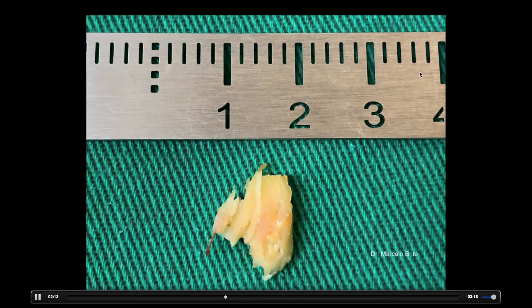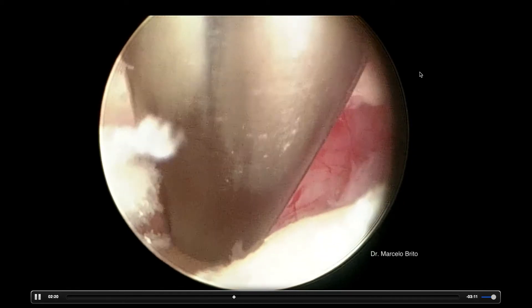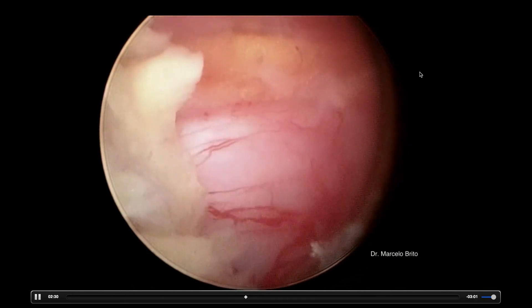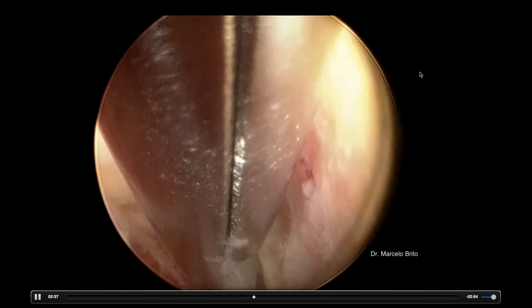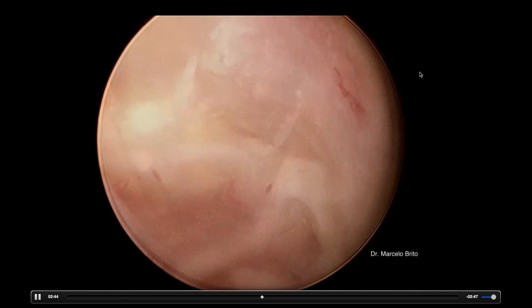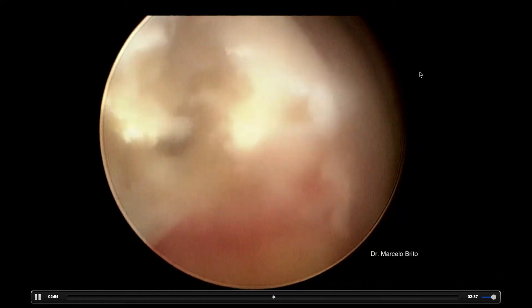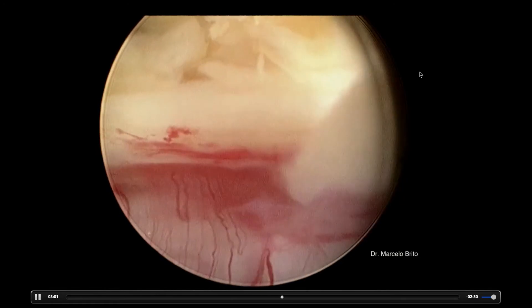This shows a big piece of the yellow ligament. And now we start to see a decompressed dural sac, but it's only the ipsilateral side — we need to complete the decompression. We see a little bit more yellow ligament, so you use the scope, you navigate with the scope, and you see if you need to complete the decompression on the upper lamina and the lower lamina, and you can free the dural sac. When you are satisfied with the ipsilateral side, you can now start to take the yellow ligament off the top of the canal. You see at 6 o'clock the dural sac, and at 12 o'clock the top of the canal with much yellow ligament.